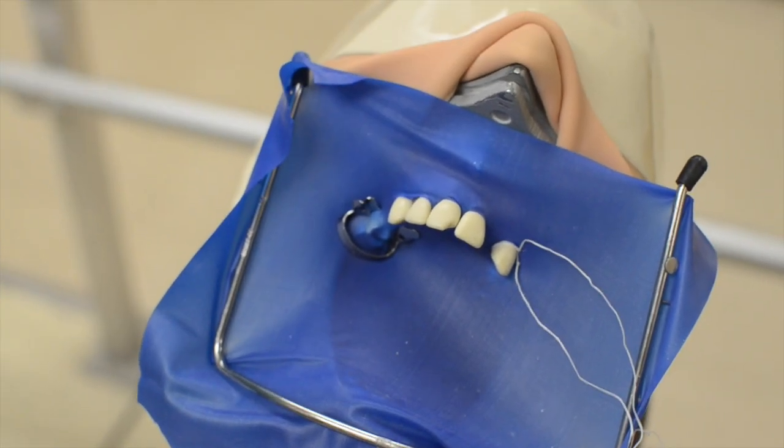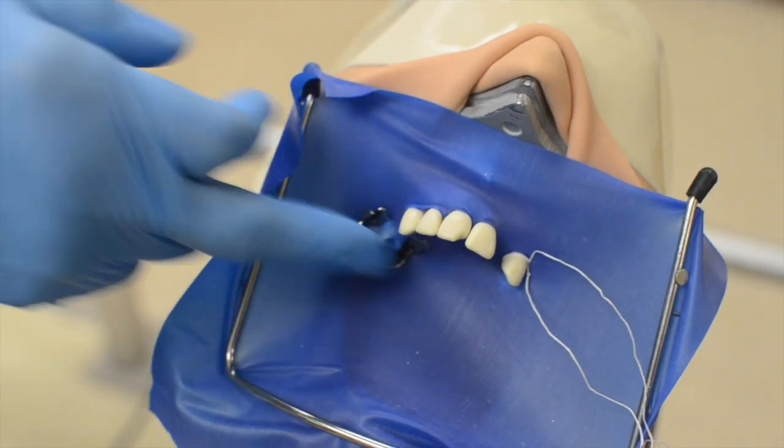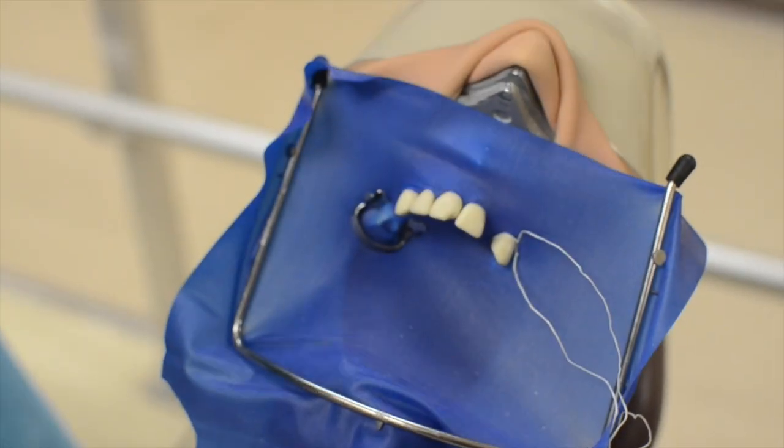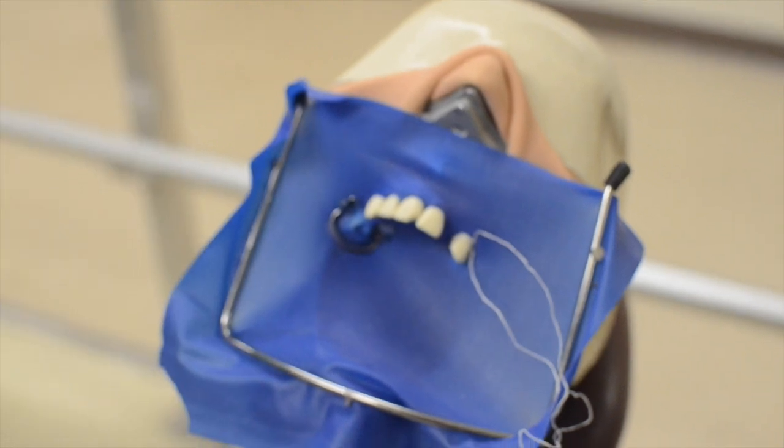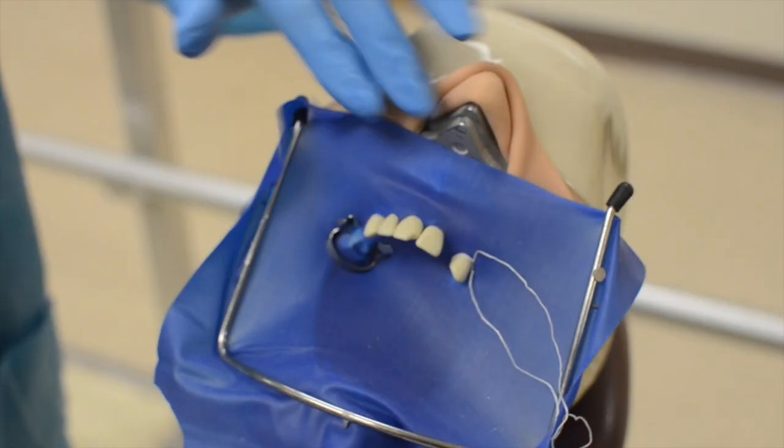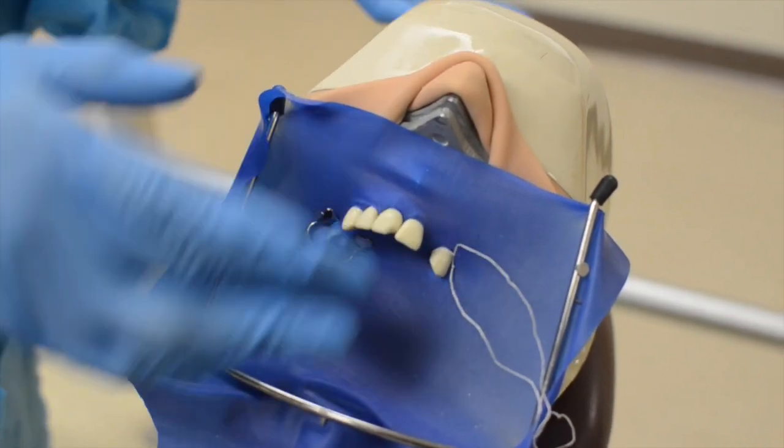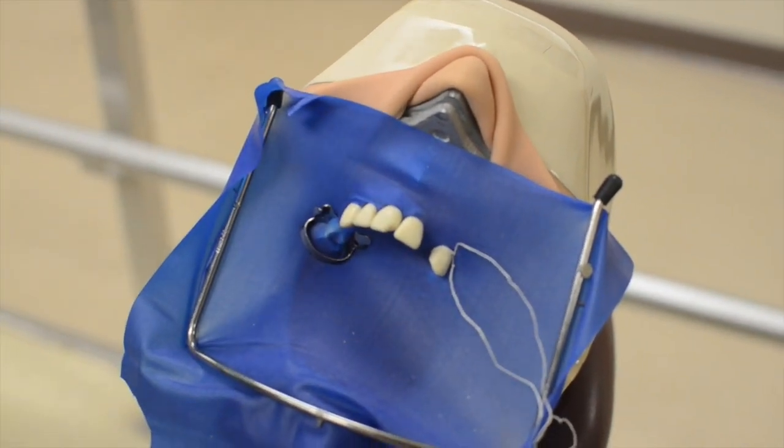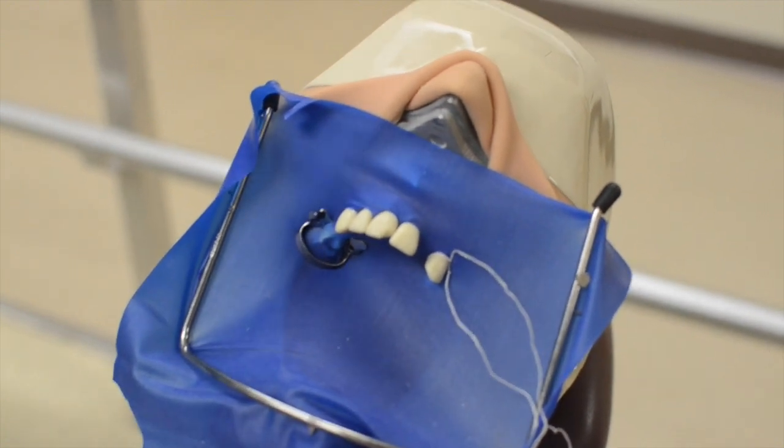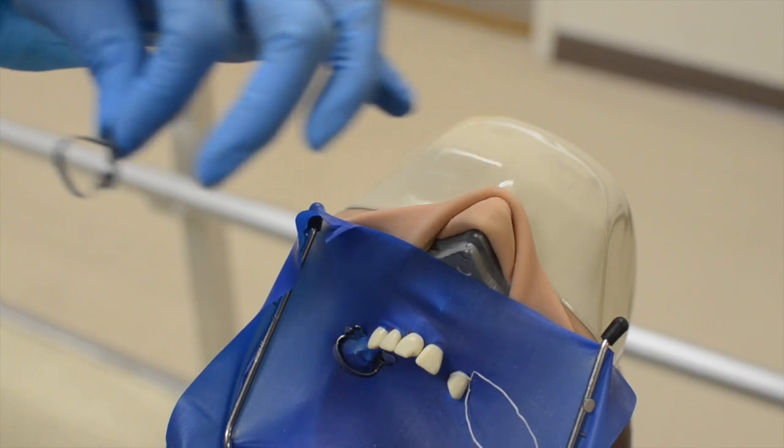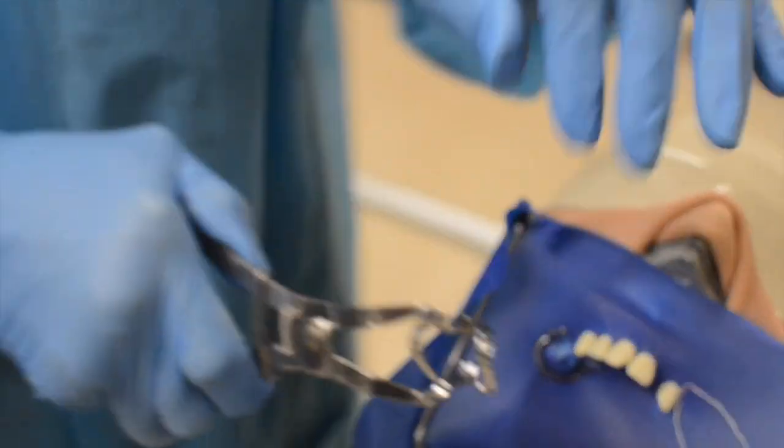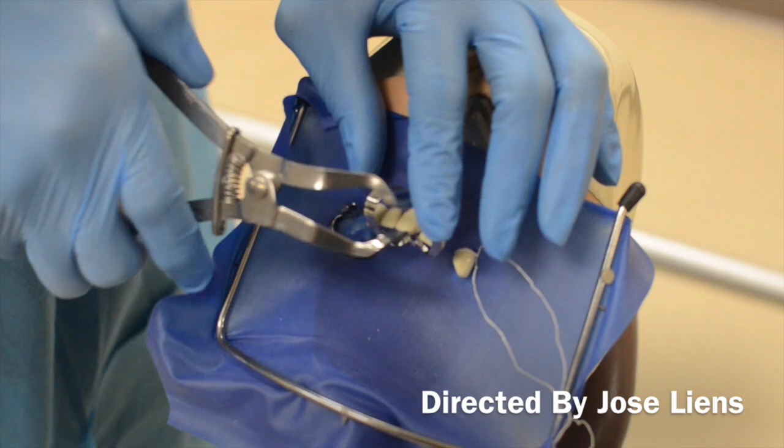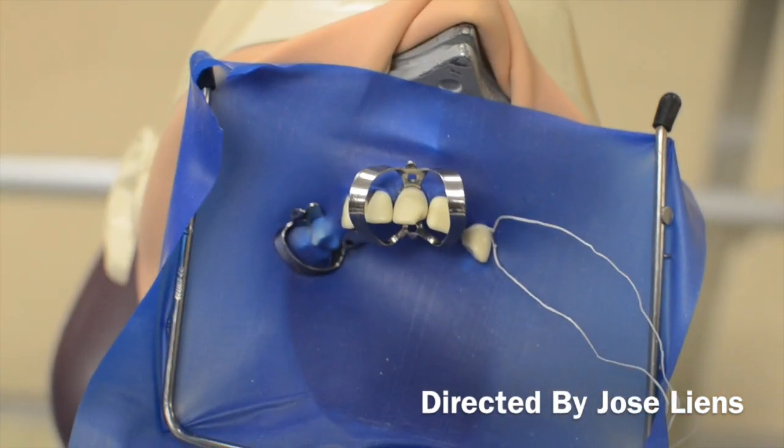Any questions? You have to have autoclaved clamps. All of this is going to be autoclaved. That's it. You guys are ready for your licensure exam. You're ready to do your class three. This might work for a class five, but if the gingival margin is in the sulcus, maybe this isn't the greatest method for you to use. If that's the problem, you've got this little handy device, and it will push the gingiva away. That's it for now. Thank you.